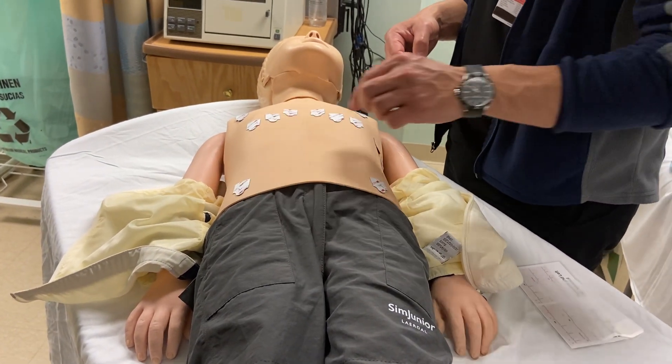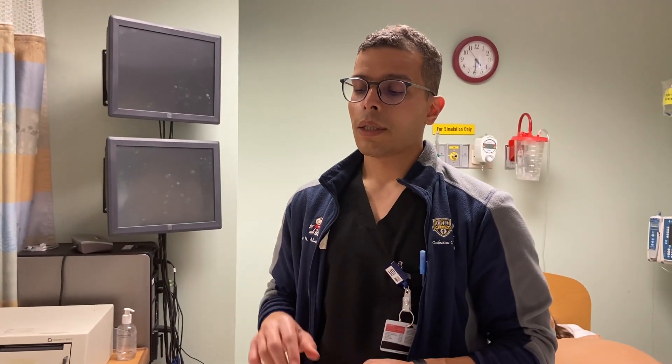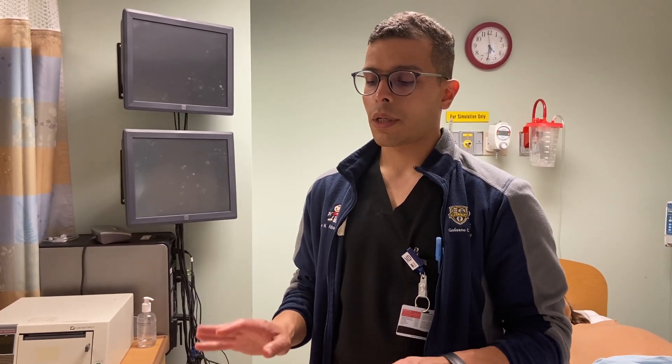Always remember to enter the medical record number in Muse with an 'E' at the beginning. If it's not an urgent EKG, it's okay to wait two minutes to let the child settle down so there's no artifact, or minimal artifact.